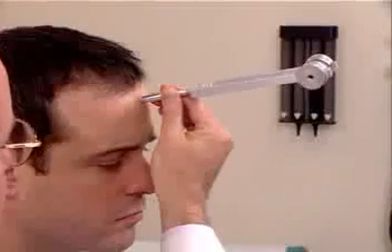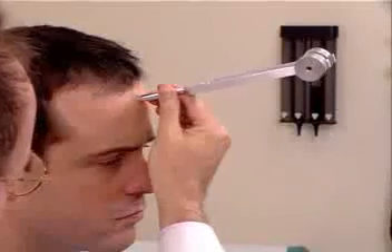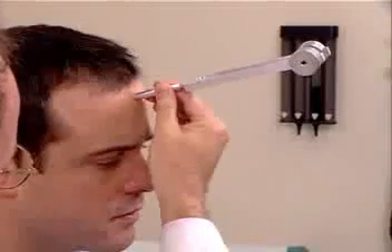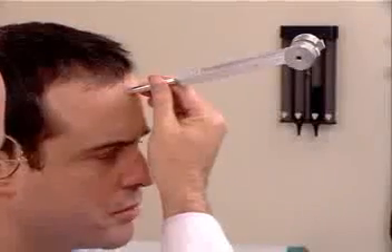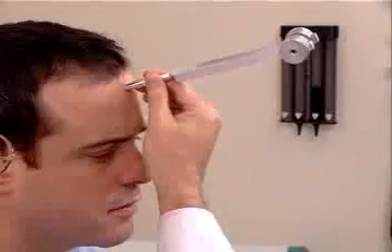The second test is the Weber test. One strikes the tuning fork and places it midline on the patient's forehead. The patient is asked, do you hear or feel anything? Yes. Okay, tell me what you hear or feel. Vibration. Okay. Where do you feel it? Both sides of my head. Does it feel equal or is it in one place louder than another? No, it feels equal. We call that no lateralization, and that is the normal Weber test.